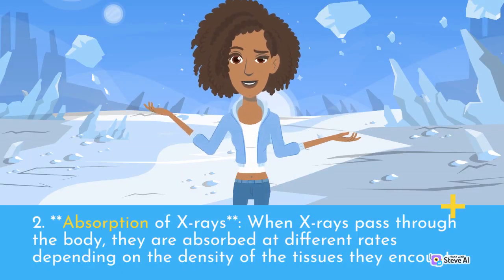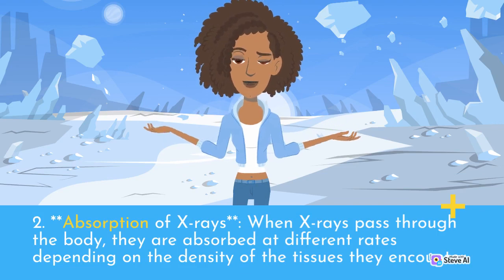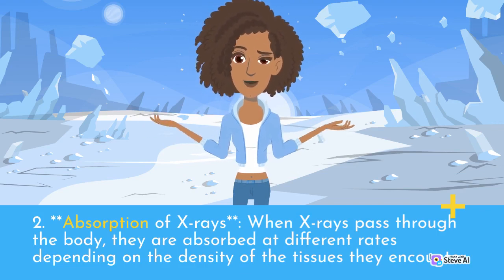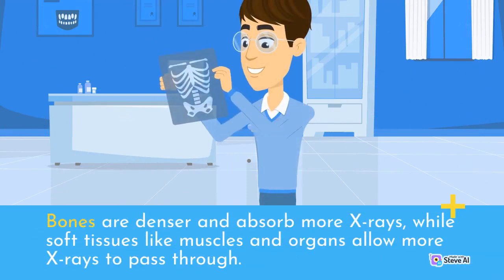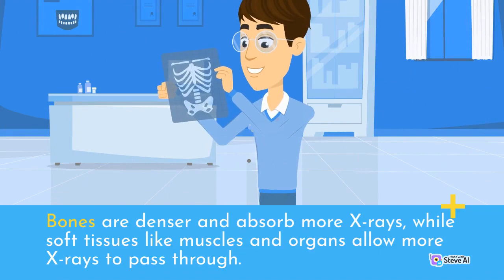2. Absorption of X-rays. When X-rays pass through the body, they are absorbed at different rates depending on the density of the tissues they encounter. Bones are denser and absorb more X-rays, while soft tissues like muscles and organs allow more X-rays to pass through.